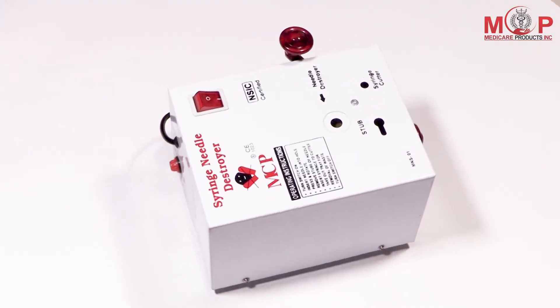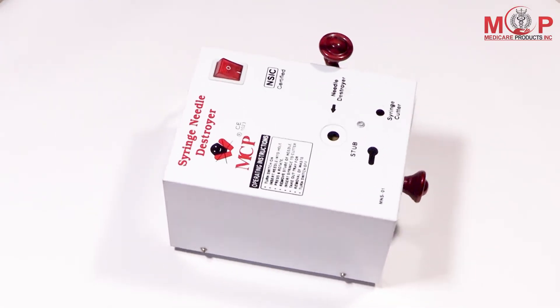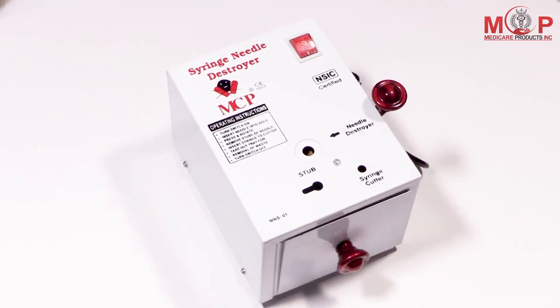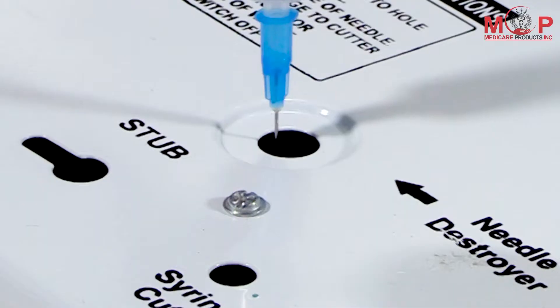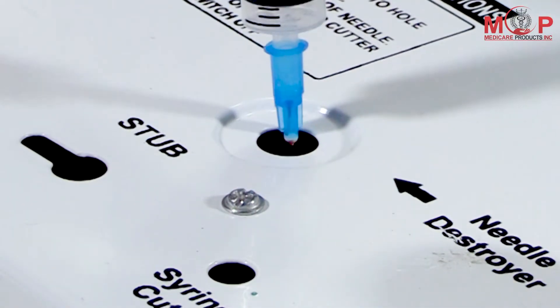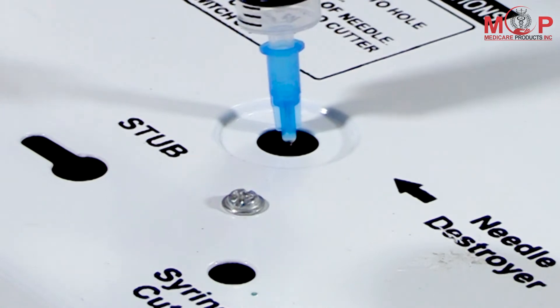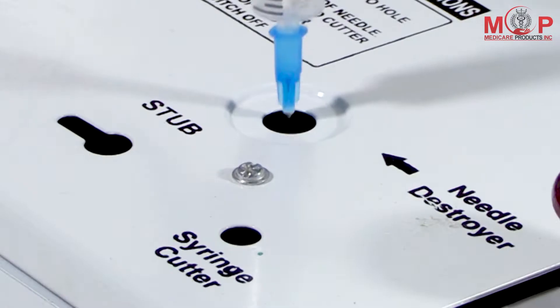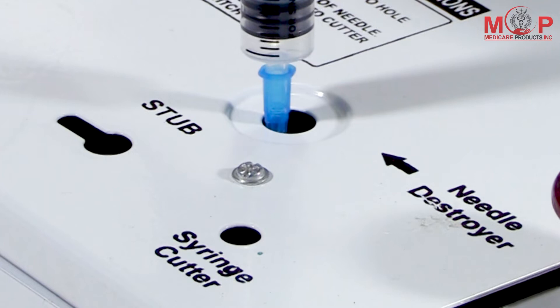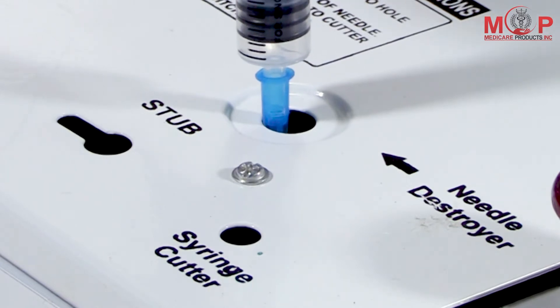Presenting MCP Electric Needle Syringe Destroyer MNS-01. It is very easy to use, hygienic and has no maintenance cost. The needle syringe destroyer is an instrument that helps in prevention of HIV AIDS, by destroying the needles and barrel of syringes so that they are not reused.